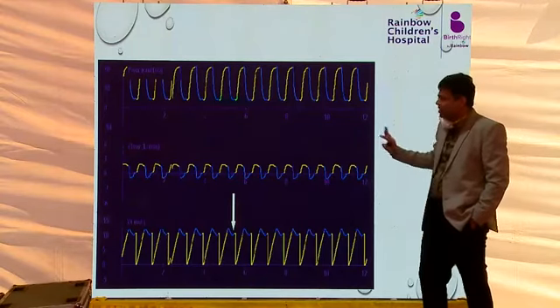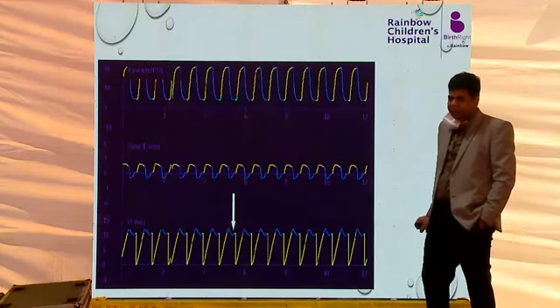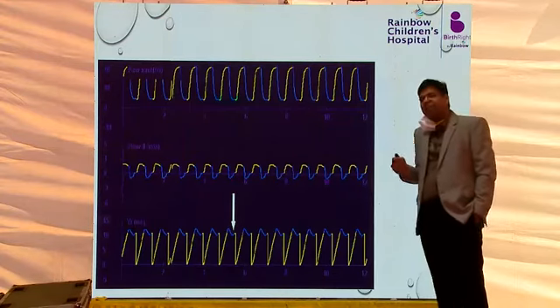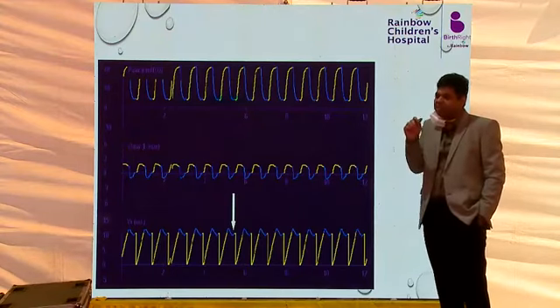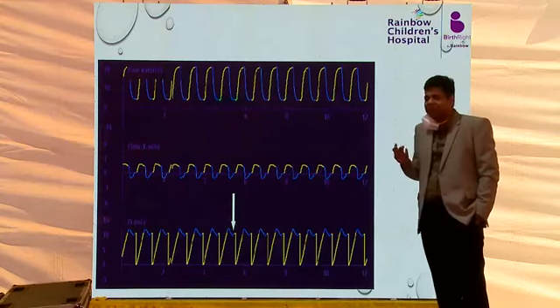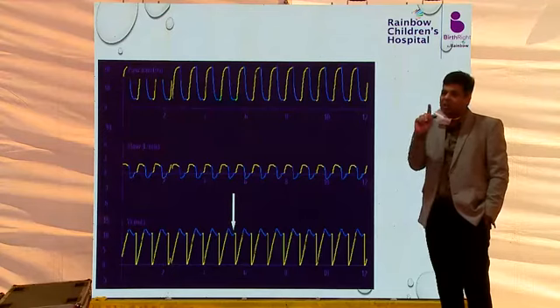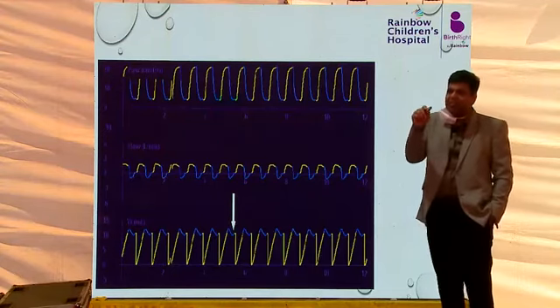The respiratory rate was set at 60 breaths per minute, and now we have increased the rate to 120 breaths per minute. Now the baby is not breathing, the machine is giving 120 breaths per minute. So this is auto cycling. Have you heard about auto cycling? If there is water in the circuit or if there is a peritubal leak, the flow sensor will judge the changes in flow as a breath initiated by the baby. If there is too much water in the inspiratory circuit, the same flow going on in a single inspiration may be calculated by the flow sensor as a first breath, second breath.